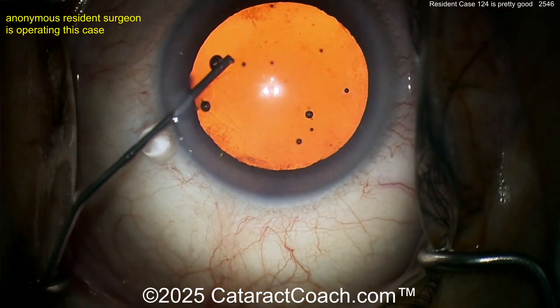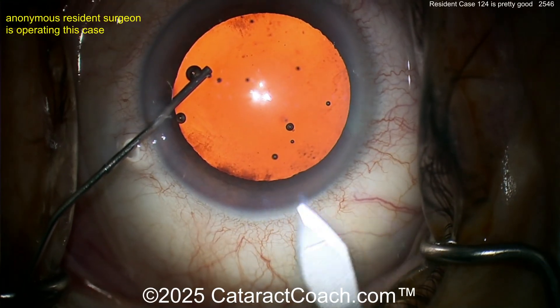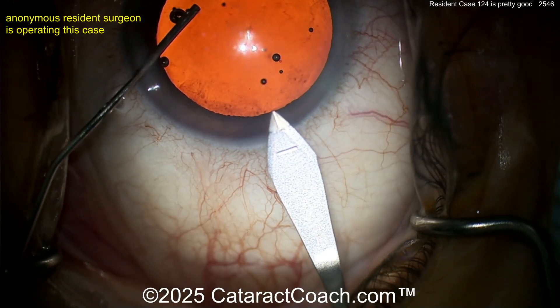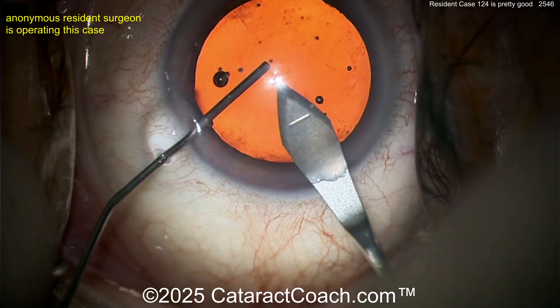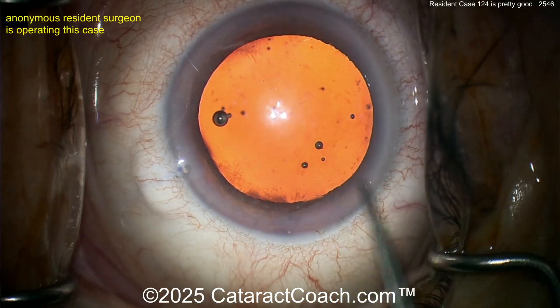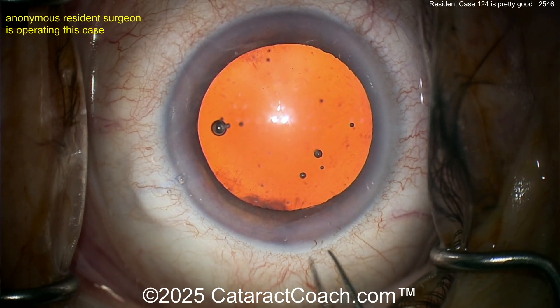Here comes the viscoelastic — nice fill of the viscoelastic, that looks really good. Now fixating the eye with the cannula of the viscoelastic and coming with the keratome. Let's watch the incision — looks pretty reasonable. I don't love that dimpled-down technique, but maybe your attending told you to do that. Not a bad incision, I'll take it.